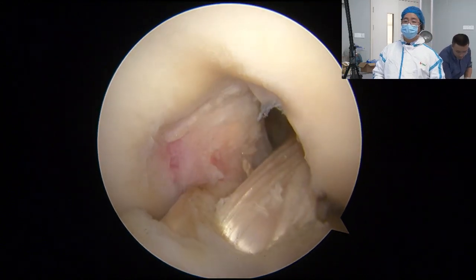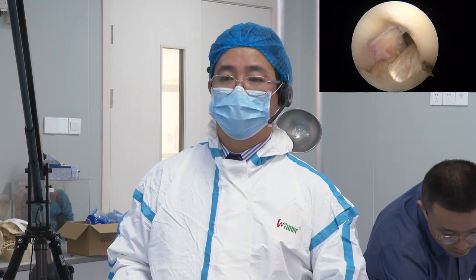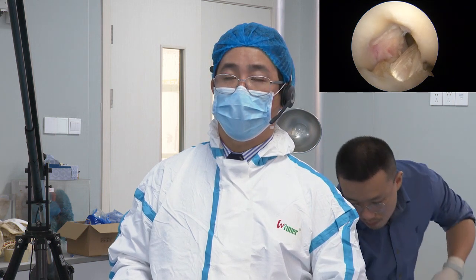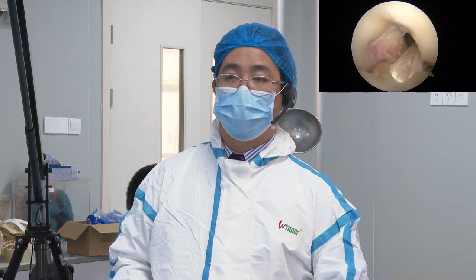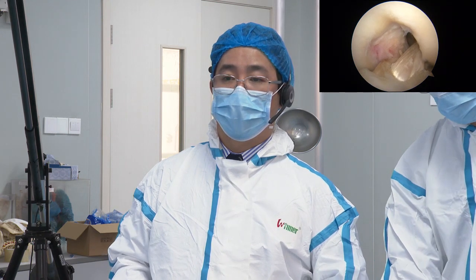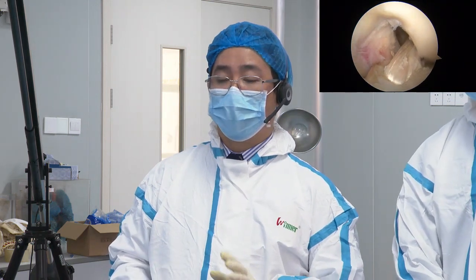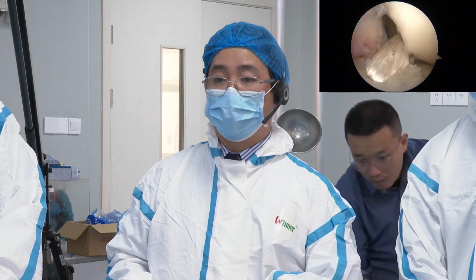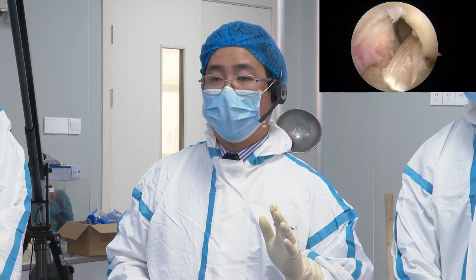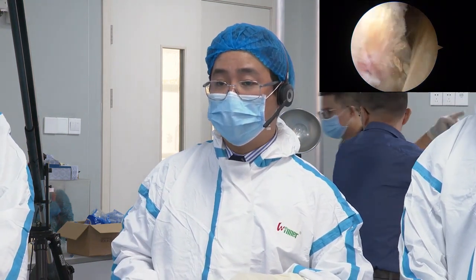Okay. And then the second question is, you recommend the tibial tunnel is more close to the medial compartment. Are you concerned that it may impinge on the PCL? You know, the PCL is very close to the ACL. Yeah, right. So that's why I put the screw posterolateral. When you put the screw posterolateral, your graft will be pushed to anteromedial, so you have less chance of impingement. You see here, you still have some space between the ACL and the PCL.